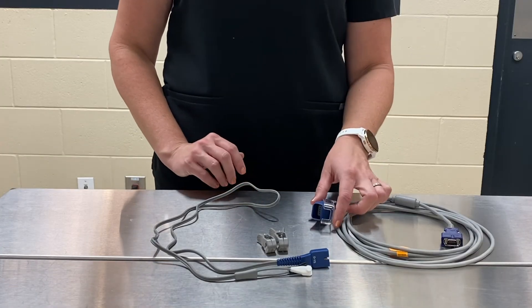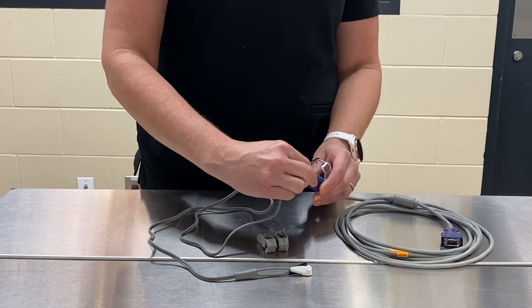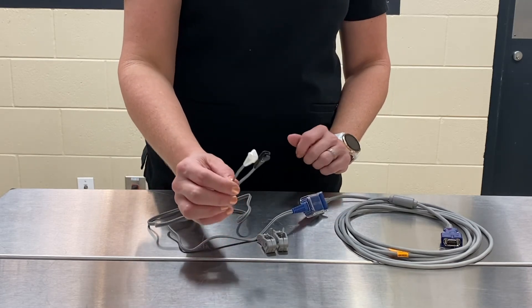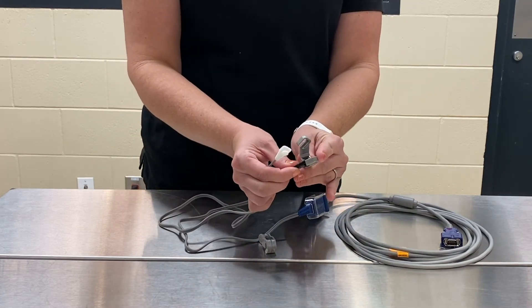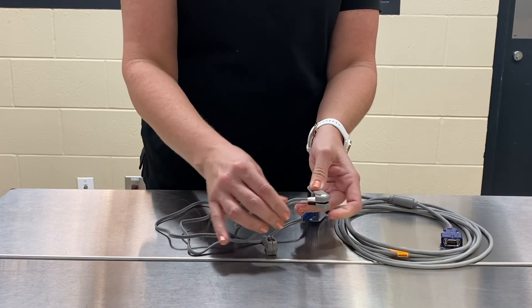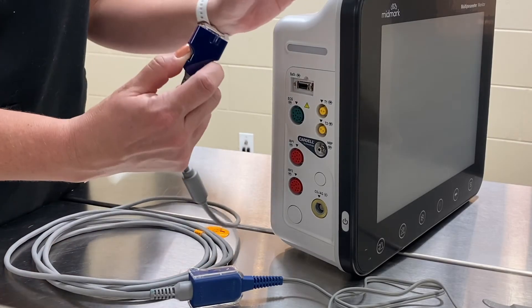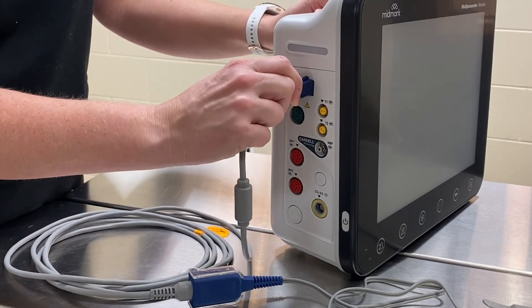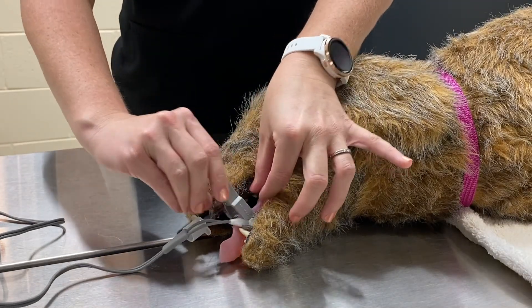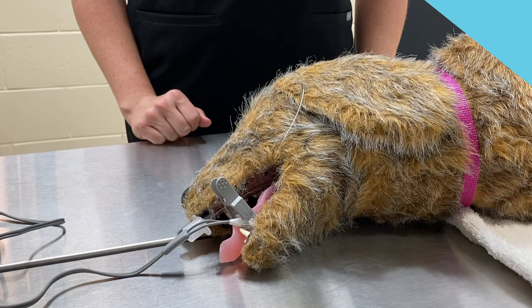To connect the SpO2 sensor, first plug the sensor wire into the SpO2 cable and close the clear cover. Next, gently slide the sensor pads into the appropriately sized clip. Plug the SpO2 cable into the SpO2 port on the monitor and clip the sensor to the patient's tongue. Alternatively, the sensor can be placed on the animal's lip, toe, ear, prepuce, or vulva.